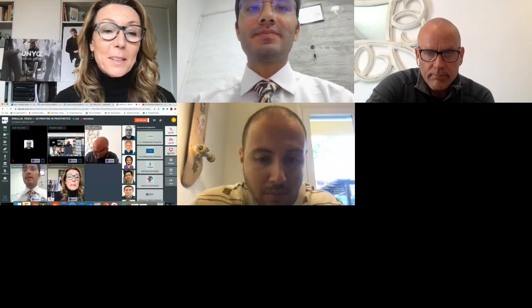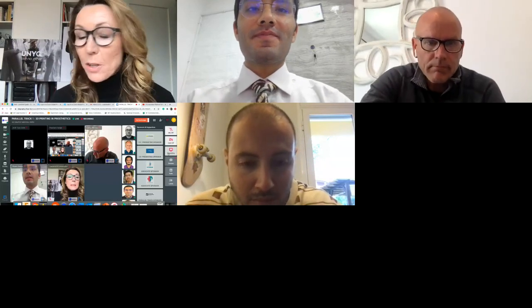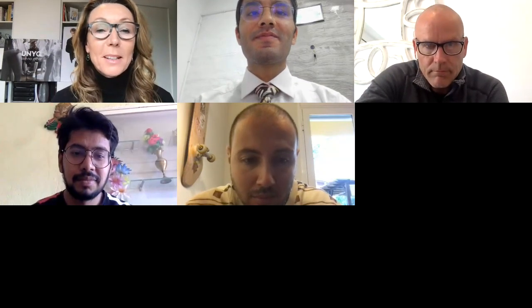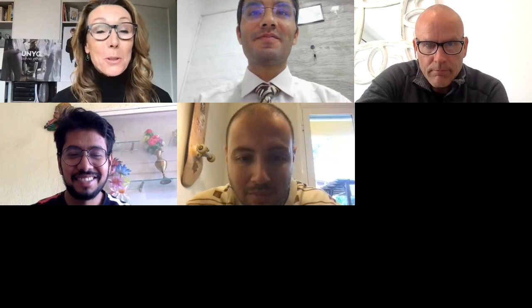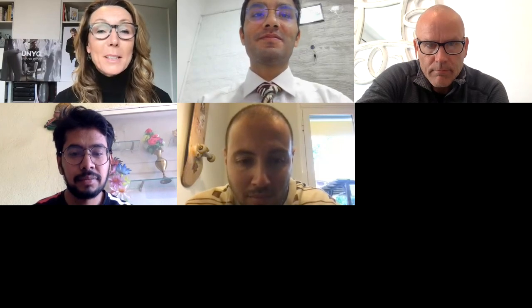I would just like to thank you, Bharat. I saw that we had similar insights, Mr. Prashant, because he also talked about aesthetics and weight being 70% and function 30%. That surprised us as well when we did the research. Everyone thinks function is the most important thing, but for someone who has to use these devices every day, for their whole life, aesthetics and weight are really important. That is when 3D printing technology is preferable over anything else right now. So I think it is important to realize, listening to the users.